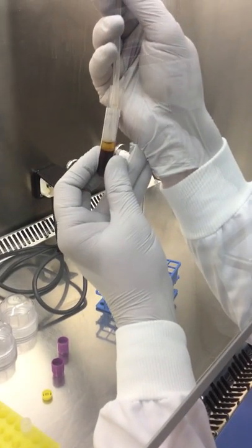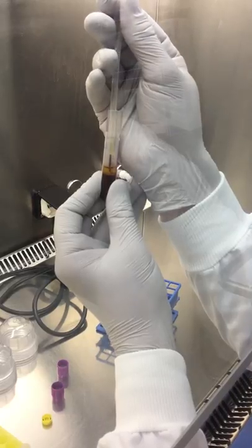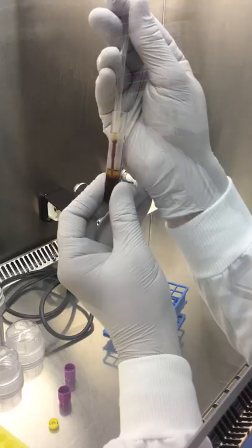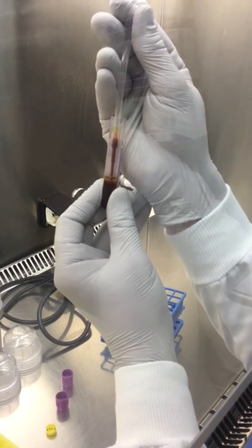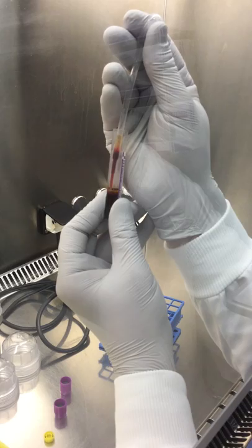Just a fraction of a millimetre above it. Start pulling it up. You can move the tube around, so move the pipette around the top, just hovering above. Make sure you can take up most of the Buffy Coat in about half a mil.